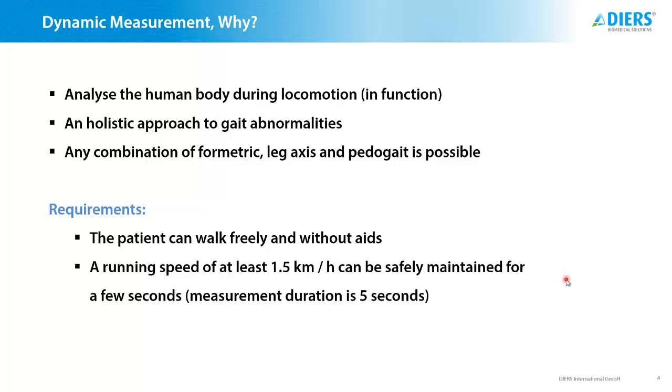It is, of course, very important that your patient can walk on a treadmill and not just can walk on the treadmill, but that the patient is accommodated to walking on a treadmill. As such, it is not wise, of course, if someone is standing on a treadmill for the first time to immediately start making measurements. The best thing to do is to have the person on a treadmill for a couple of minutes to make sure they are very well trained to walk on a treadmill, and then you can start making measurements.